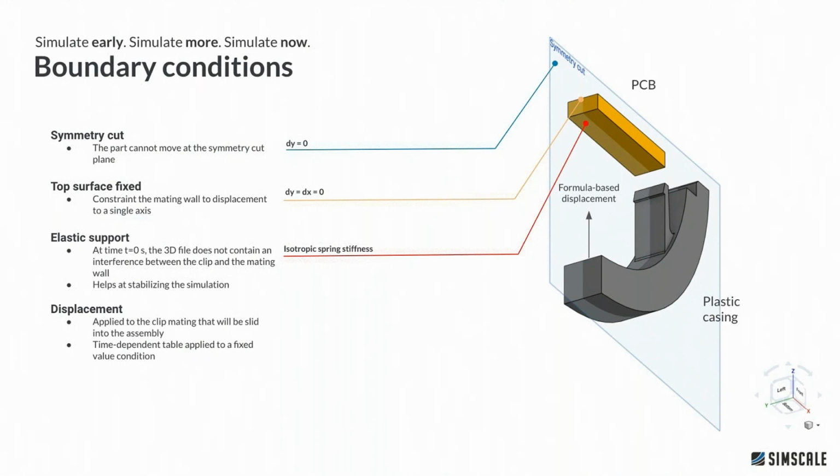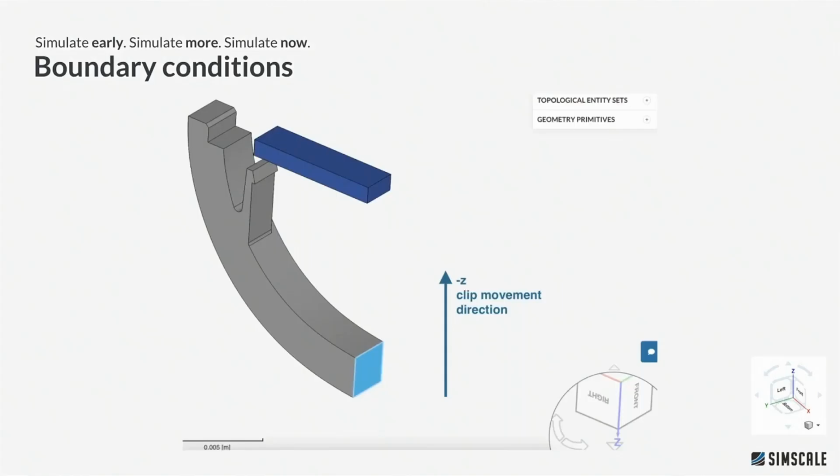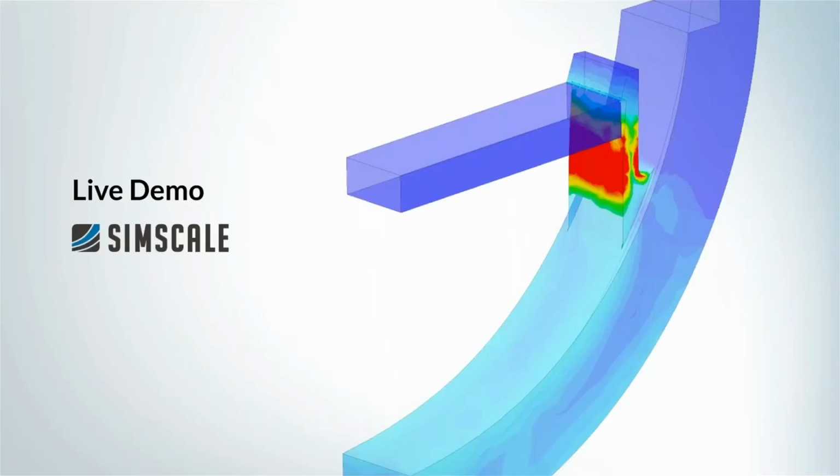Finally, we set an elastic support at the electronic board because it doesn't touch the plastic part at the initial step. So these two parts are apart from each other at the time t equals 0. So we need to set this to stabilize the simulation and to keep the PCB from floating in the schematics. Then we can move on to the demonstration of this simulation.